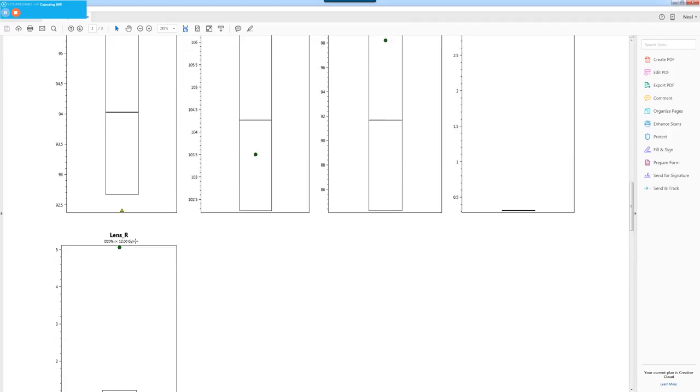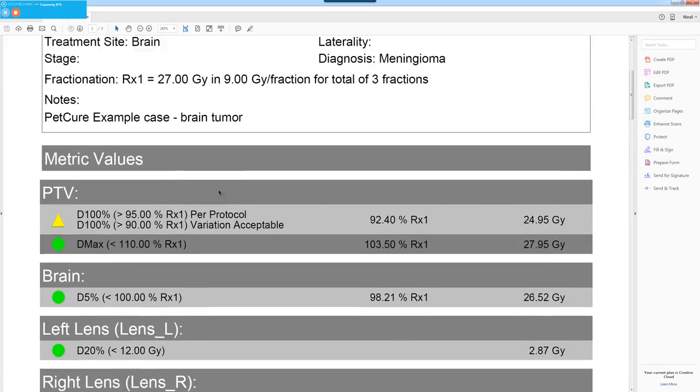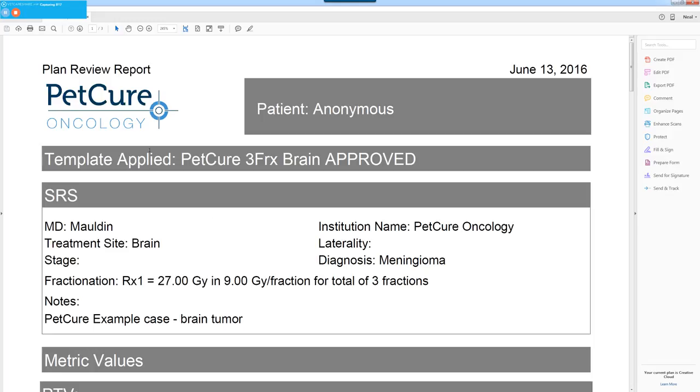This is actually a real-world patient. It's just that this data is all anonymized and not used for therapy. She was diagnosed about 3 years ago, and we just recently lost her to a completely unrelated problem when she was a 15-year-old beagle. So brain tumors and stereotactic radiation can go very well together, especially when we're talking about doing appropriate quality control and when we're trying to minimize our critical structure dose while at the same time maximizing dose to the tumor.